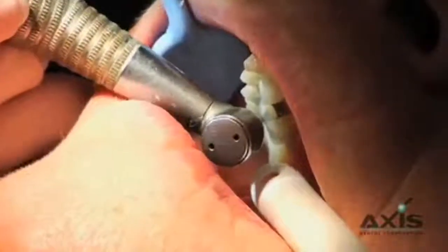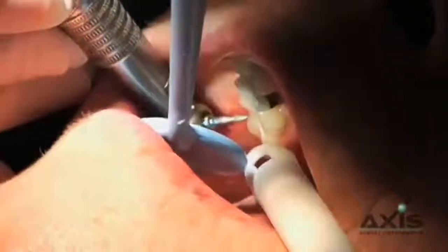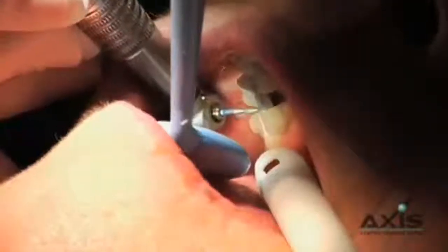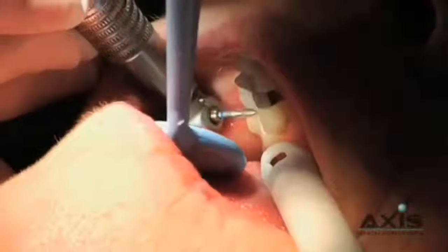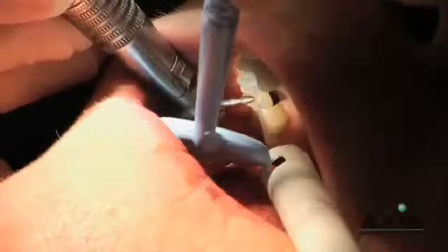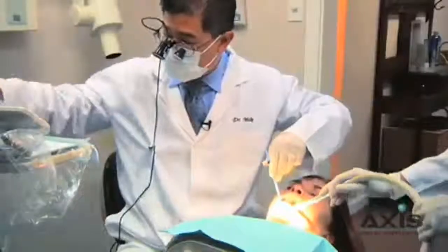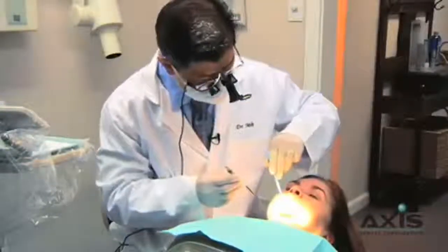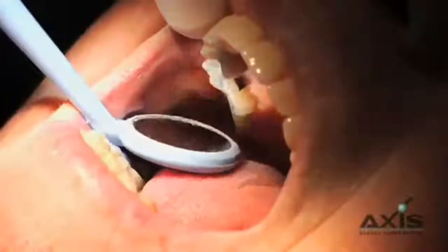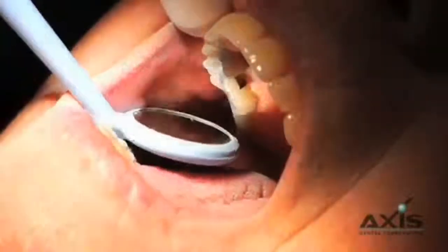Same thing — just circular motions, gentle pressure, lots of water. These Zurcut diamonds do a great job; they're just so gentle on the porcelain. These are intricate restorations and the diamond is being very gentle, not generating a lot of heat or micro-fractures. So you can see we have different types of marks now, looking fairly even going down the central groove and fossa of the restorations.